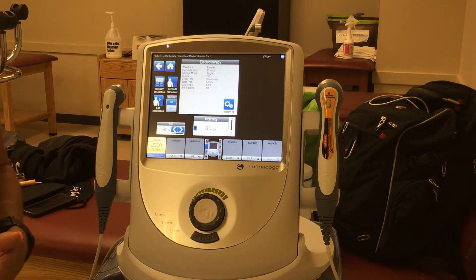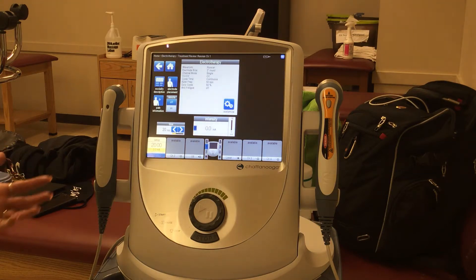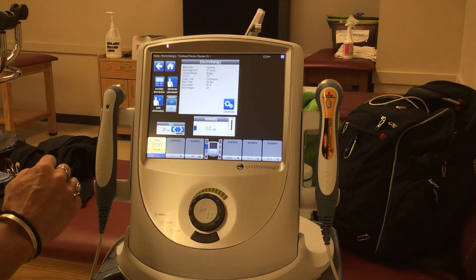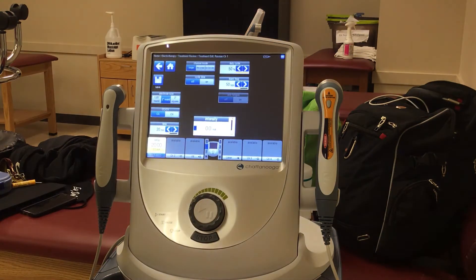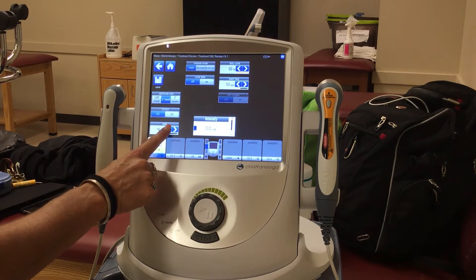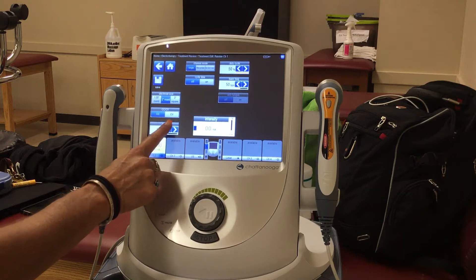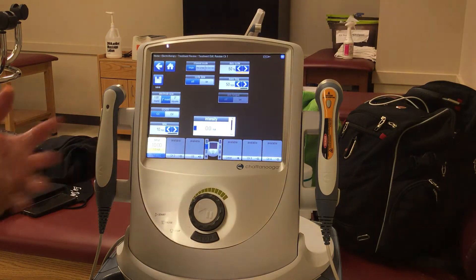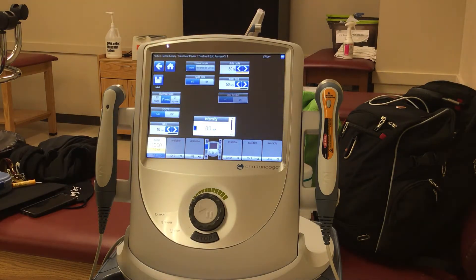We can also use it for edema — if people have chronic edema — but what I'm going to be showing you right now is for the neuromuscular re-education part of it. Notice we have the general setup, but we're going to go into customization. The very first thing I need you to change is the time. If you ask somebody to do this for 20 minutes right out of the gate, they're going to pass out and die. It's not a very comfortable thing, and they are not going to enjoy that at all.